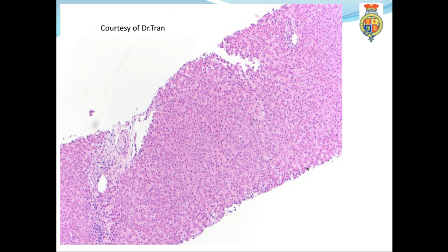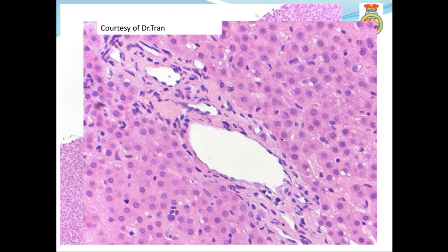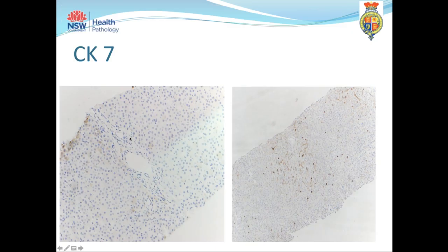So this is this young woman's liver biopsy. Again, you can see at low power, it has a relatively normal looking hepatic architecture, no obvious fibrosis. The abnormality, of course, is in the bile duct, in the portal tract regions. You can see that the hepatic vein and artery are present, but the bile ducts are absent. And in fact, on the CK7 stain in the cores submitted, no bile ducts were present. But what you can see is this increased staining of periportal hepatocytes in keeping with a chronic cholestatic disorder.